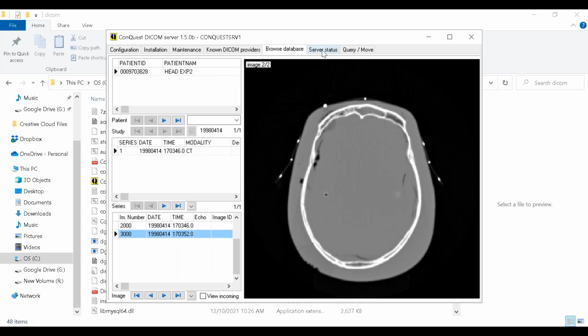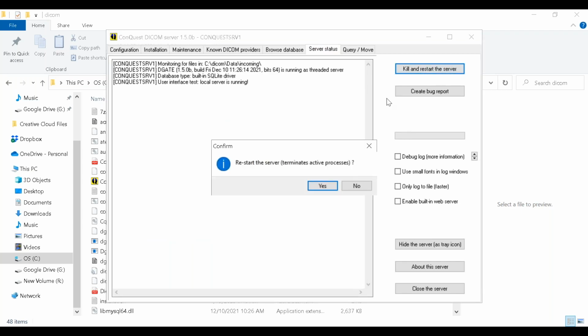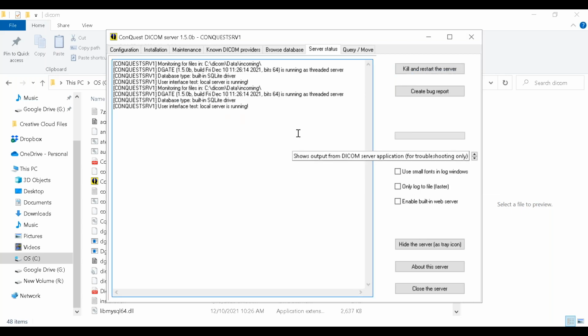Let's go over to the server status over here. Notice that over here I've got a log. I can do things like kill and restart the server, and that's going to go ahead and give me a log where it's going to stop what it's doing, and then it's going to boot back up, and it's going to say, yes, guess what, I'm running. Now, anything that I do in here is going to show up as a log.